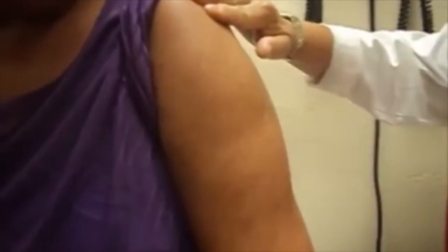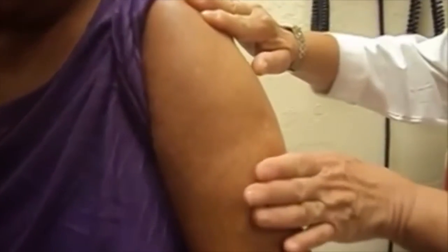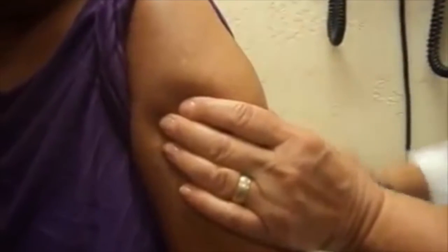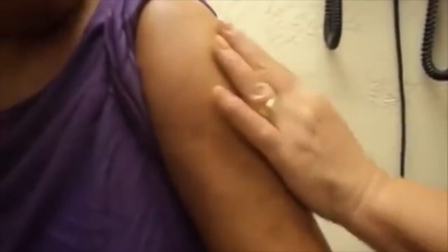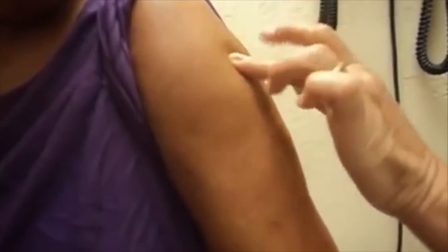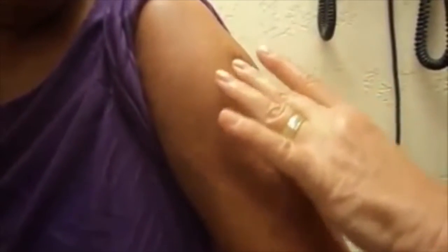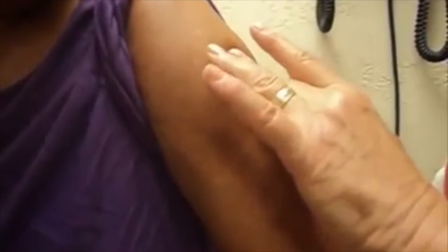In an arm injection, it's almost the same thing. You put 2 fingers on the bone, which is the shoulder, that you can feel the articulation there, and probably a hand around the elbow, and again you have this area where there's a muscle. You flex your arm. Again, you can see it when someone flexes, and I would pick the spot right here. It's a great site. When you give injections, you're going to have people relax, though.